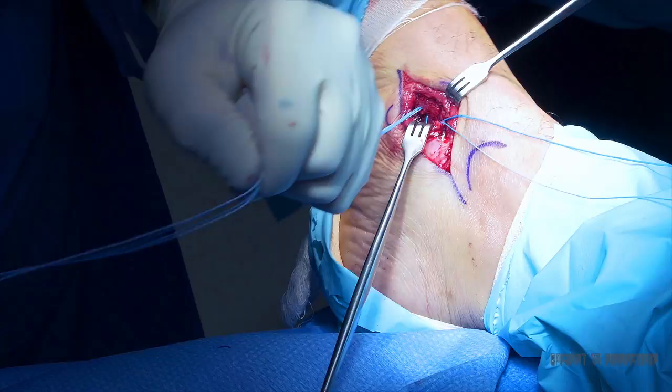According to the Stryker manufacturer, the pull-out strength of this type of suture anchor is roughly 100 pounds.